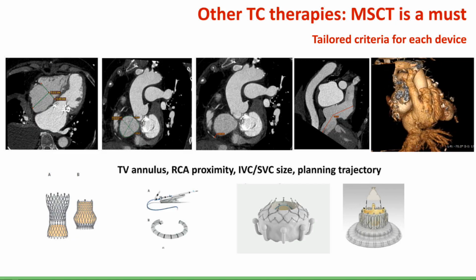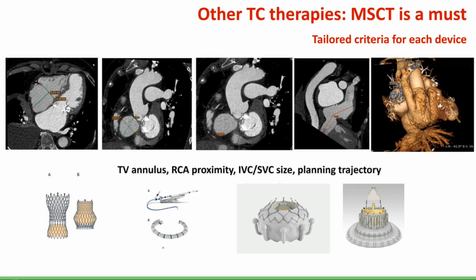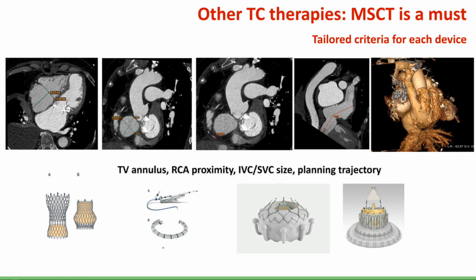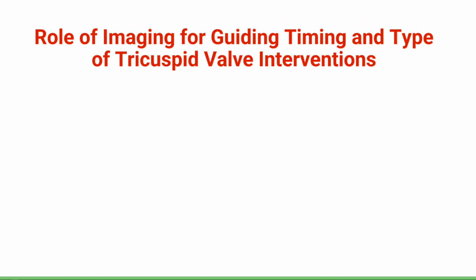Indeed, in our institution, because we are also doing percutaneous annuloplasty, every single patient that we approach for a transcatheter therapy, we do CT plus transesophageal echocardiography.